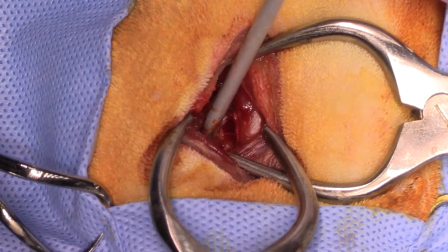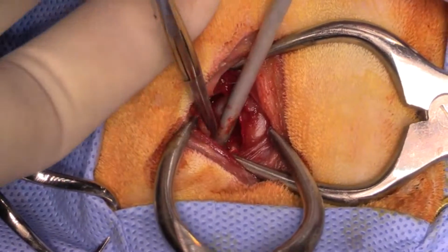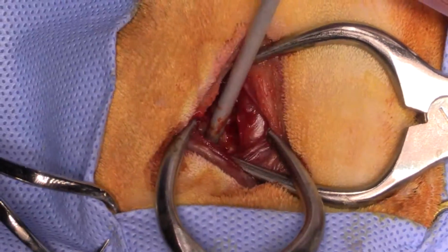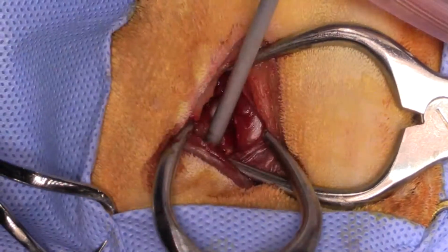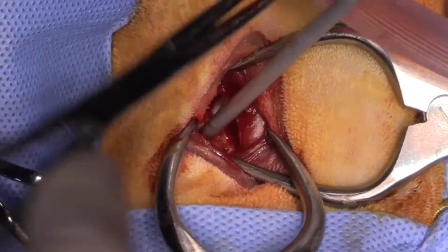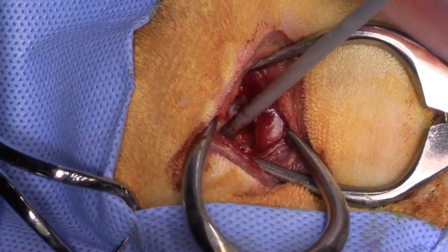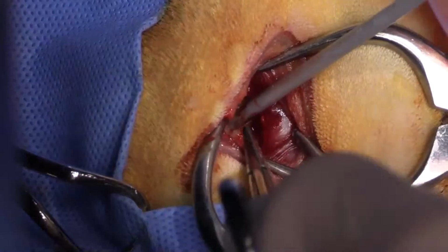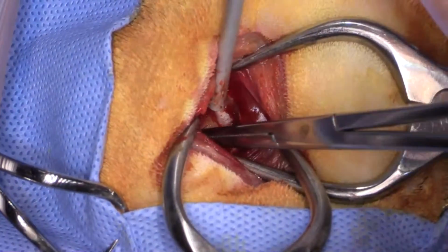My hemostat, please. Hemostat. If we can't find it, I'll take... Yep. And I can actually put a right angle out through the ear canal. So that's going out into the external ear canal right there.